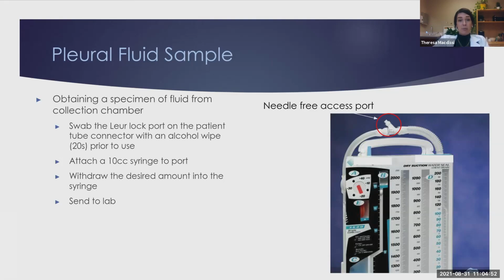If your chest tube becomes inadvertently disconnected and you are trying to get the drainage system device set back up again, say it got knocked over, the tubes popped apart, you can clamp the patient's chest tube in that instance while you're waiting to get it reconnected. And then with physician orders, when we are assessing the patient's tolerance to chest tube removal, or when we are actually having the chest tube removal occurring, the chest tube will be clamped.